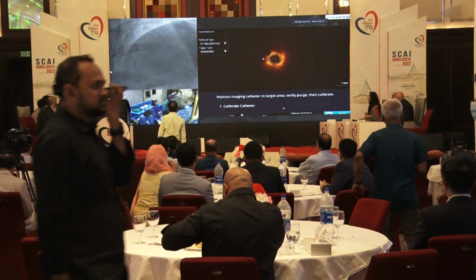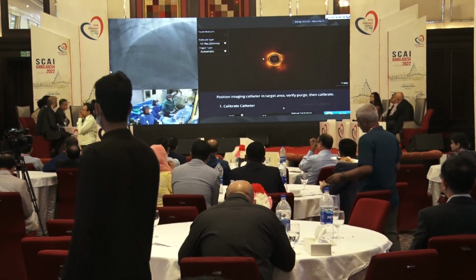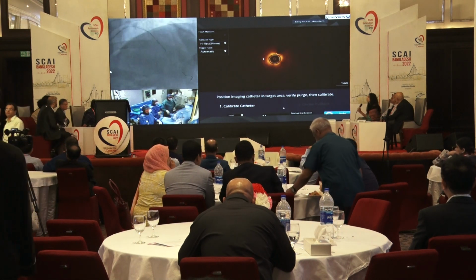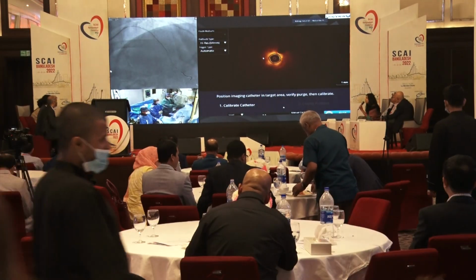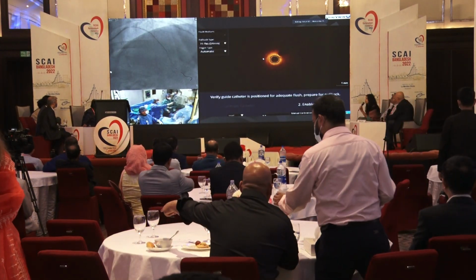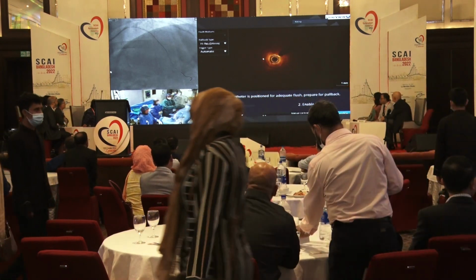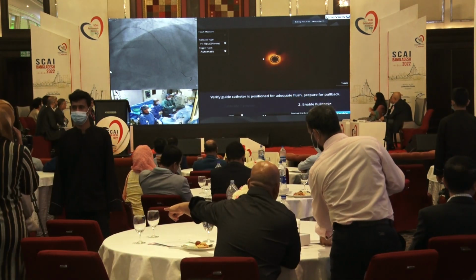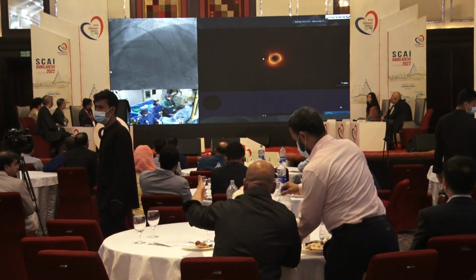I'm not planning to stent. I would stent the long LAD only if I have a very bad dissection. So Damiano advanced the OCT. The OCT is now across the bifurcation. Enable to pull back. Okay, we are ready to do the pullback.